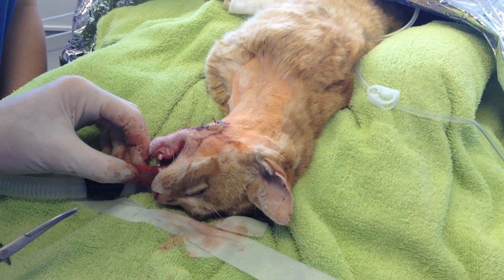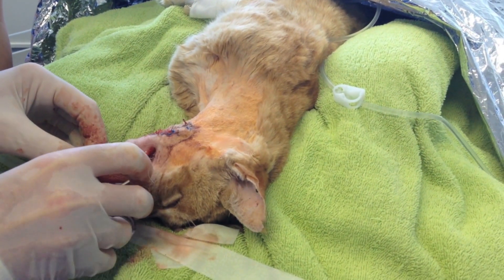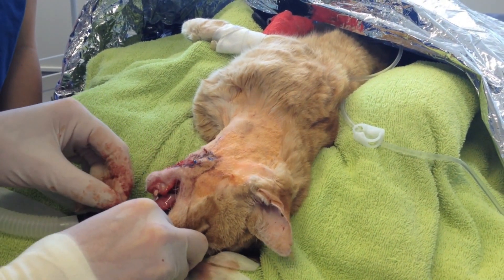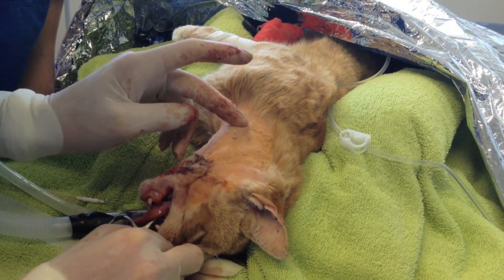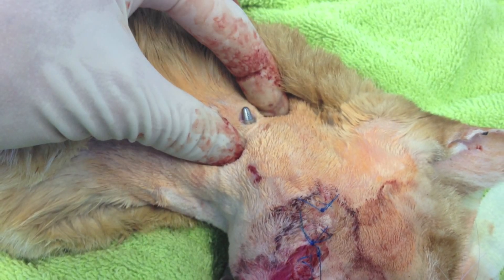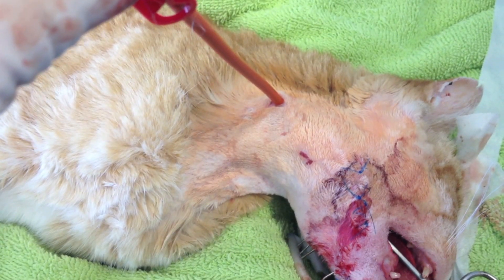The neck is aseptically prepared and we're placing a curved haemostat through into the esophageal lumen. We can palpate the point of that pair of forceps through the skin. We can make an incision and push those forceps ends through the skin, and we can grasp our tube.